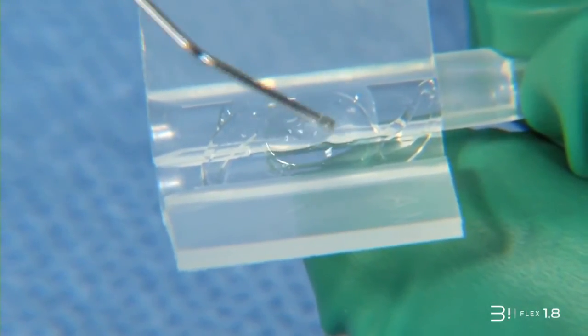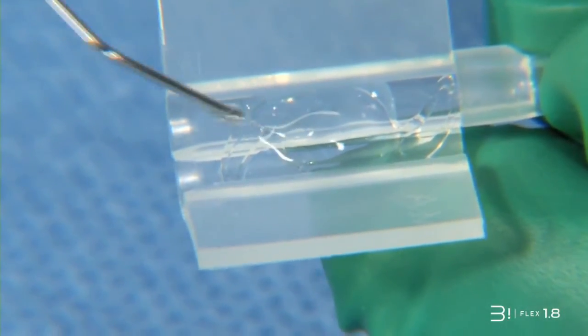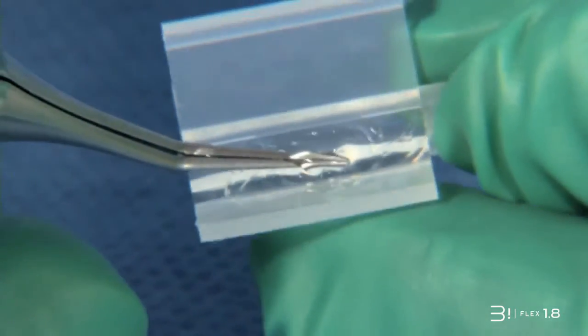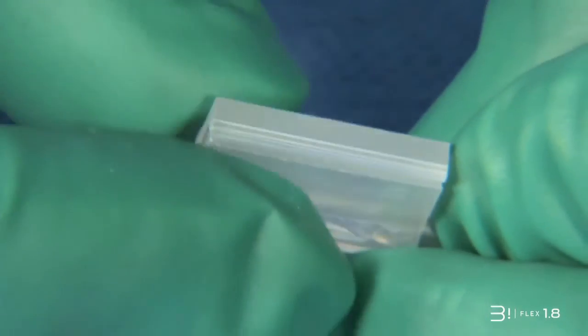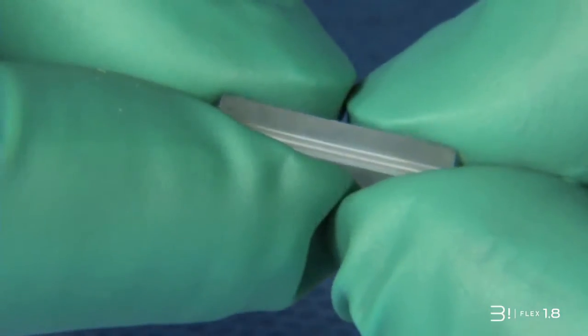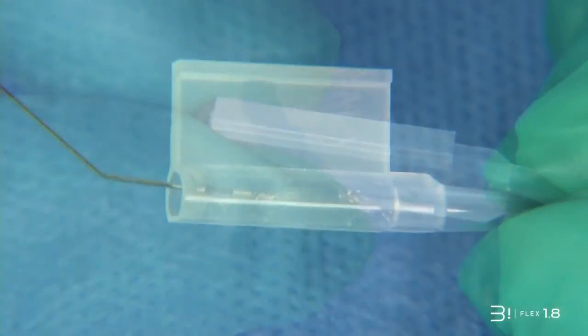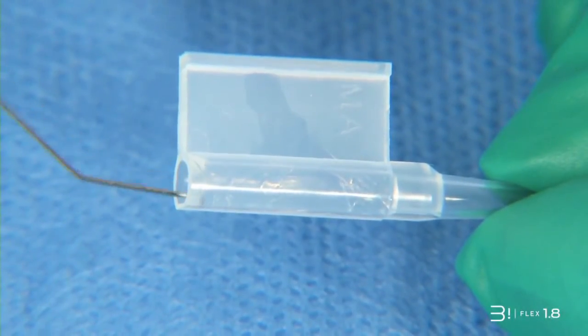Add a bit more viscoelastic gel above the lens. Close the cartridge. Be sure the implant does not move and inject some visco gel into the cartridge on both sides.